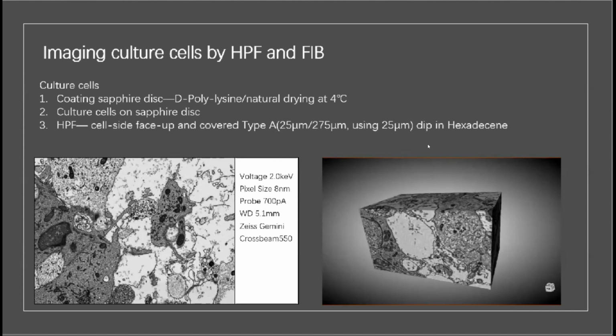It means you can just prepare and leave in 4 degrees, and it can dry for whatever time. So when you need it, you just take them out. Yes. Okay, but another thing is when you put it into 4 degrees, as you are going to put it into culture later, basically you need to also use UV to make sure nothing is growing, right? That's before you culture. Yeah. Always use the UV. Yeah. Thank you.